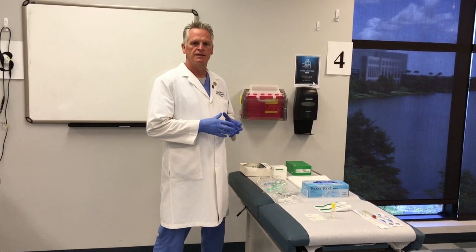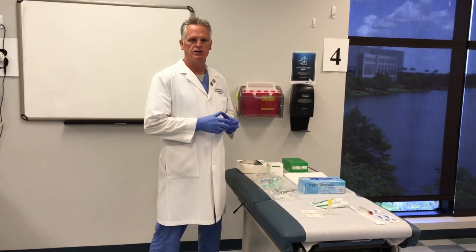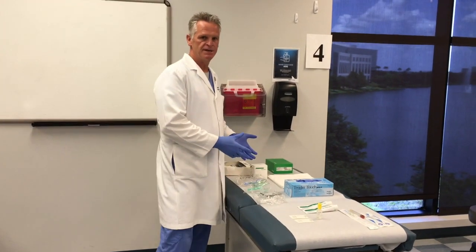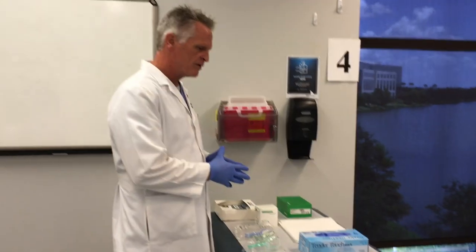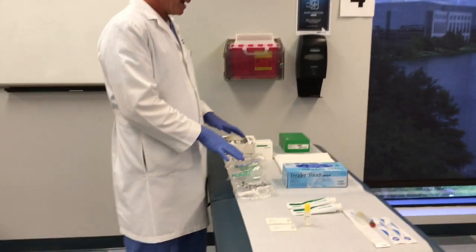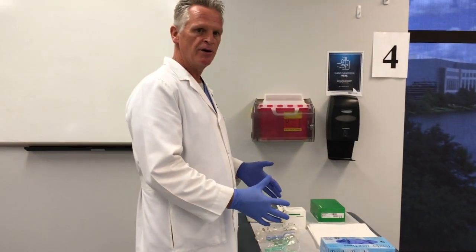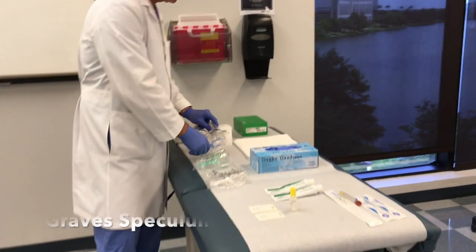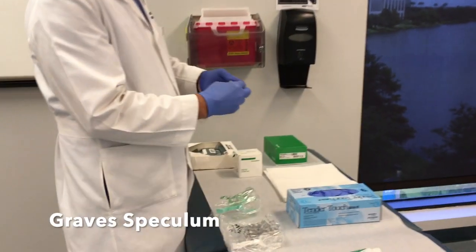Today we're going to discuss the female breast and GU exam. Before we begin, it's important to understand that we have different types of speculum based upon our patient's body habitus. First, there are the Graves speculums, which are a much larger speculum and come in stainless steel.